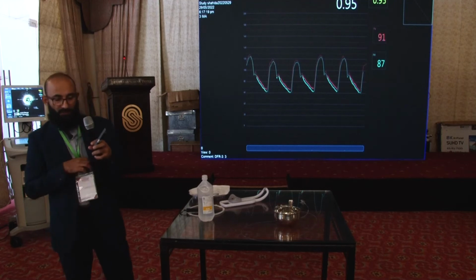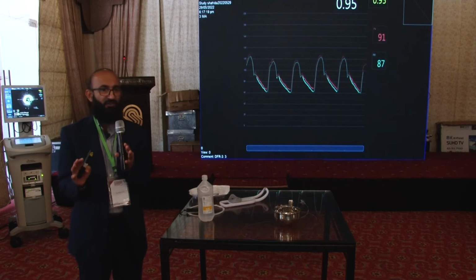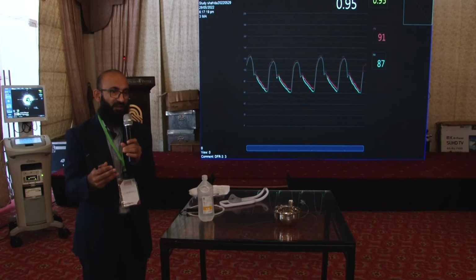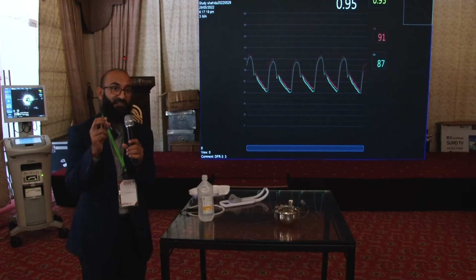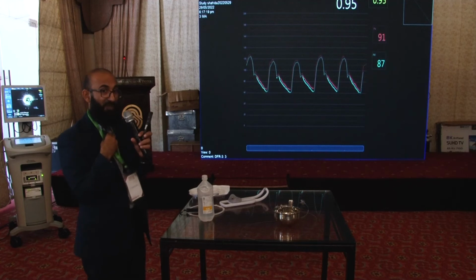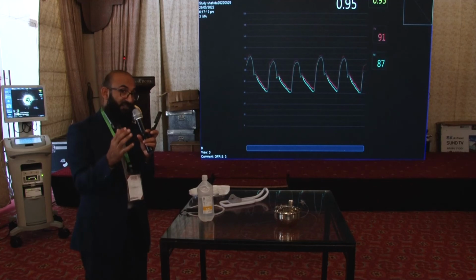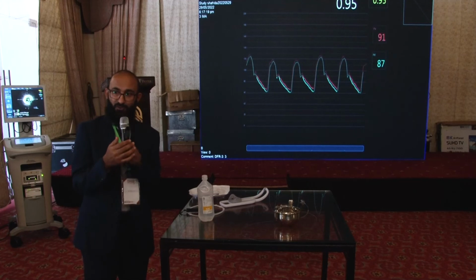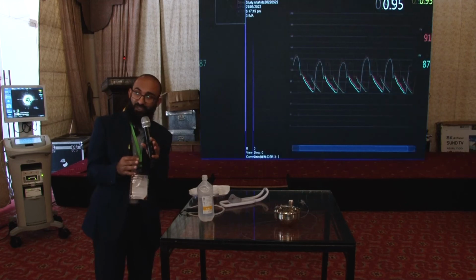The basic take-home from these things is that it really changes the way we see. Because angiography, as I have already told, has limitations. It's a 2D structure, and what appears severe to me angiographically may not be. So that's why in certain cases we need IVUS and physiology tools. Also, for optimization of the procedure, both have a role.